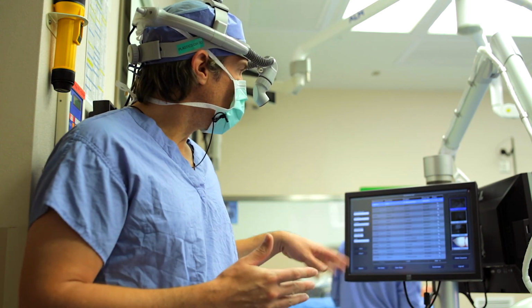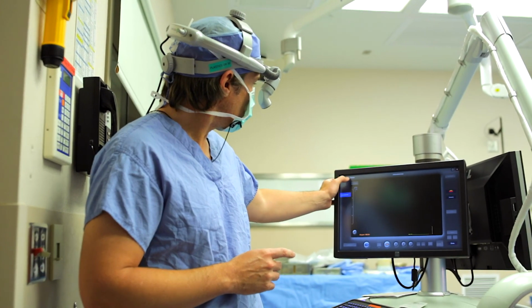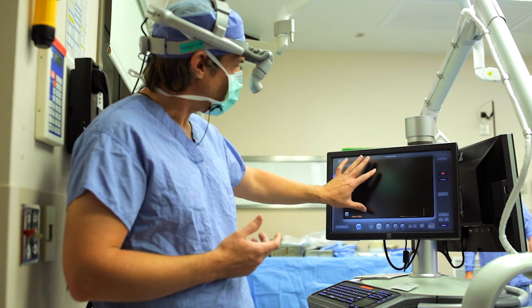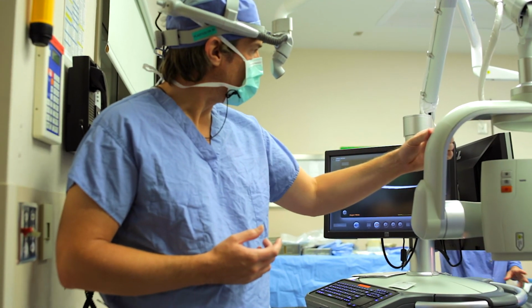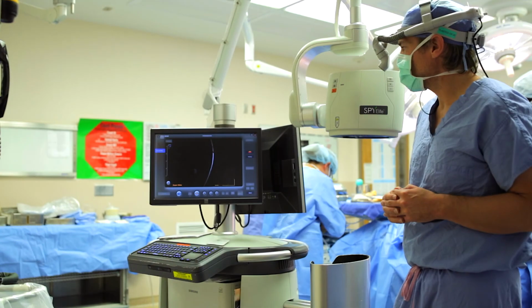So as soon as we've put that information into the patient, hit accept, you can see that now on the screen it says this patient's name and clinic number, and the screen itself is dark. Essentially what this is, the black and white camera is on. So I'm going to twist off to the other side here for just a second.